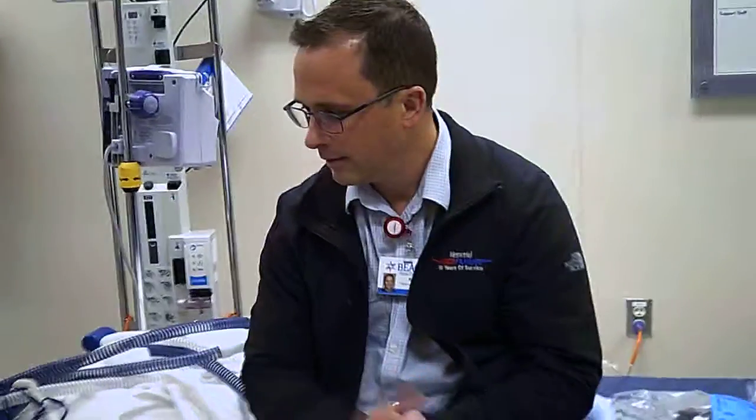Question. Can anybody tell me what minute ventilation is? This is like one of the most important things to know. No? Alright, we got a good audience today. So minute ventilation is going to be the amount of air we breathe in and out in a single minute. How we get that is going to be the respiratory rate times our tidal volume. And to be 100% proper, it's going to be our ETV, which is our exhaled tidal volume. And we'll get into that.